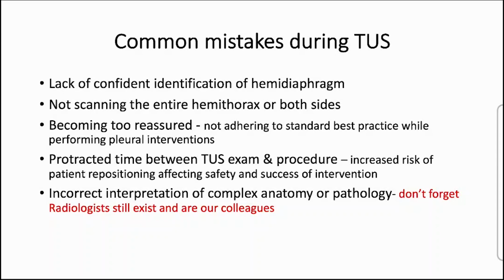Becoming too assured, that is the delusion of grandiosity. This is very important. And the protracted time between the ultrasonographic examination and the procedure. So you have done the sonography, you have marked the patient's skin, and you are doing the procedure in another room or after a later time. But by this time, there may be a change in the position of the patient, and when you're doing the procedure, there may be mistakes in getting the desired effect, and incorrect interpretation of the complex anatomy or pathology.